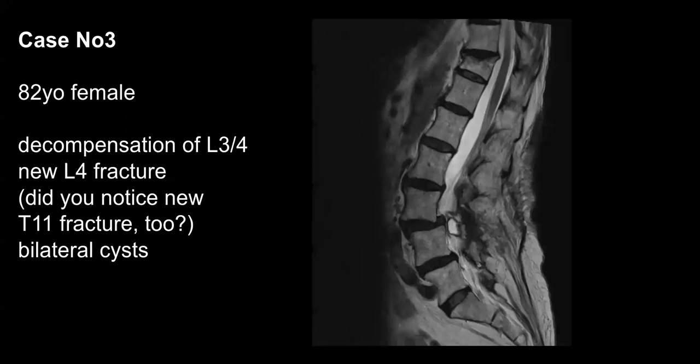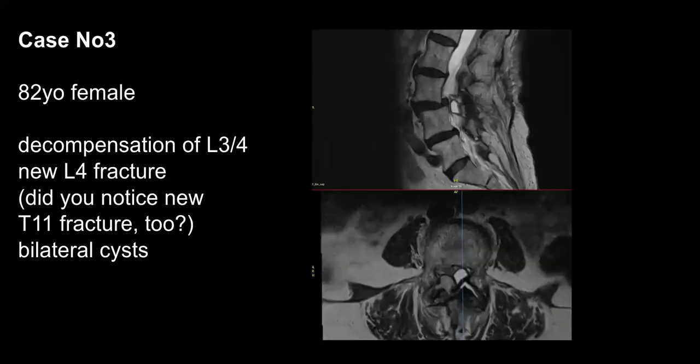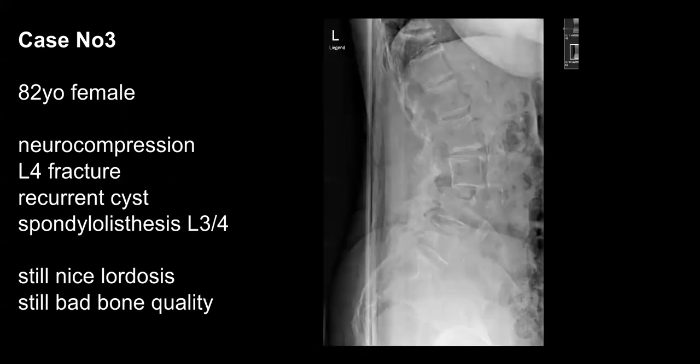What can we do now? What can we offer these patients? It's very, very severe pain. And we have still a nice lordosis, and still bad bone quality. I would love to hear how big is the instrumentation?